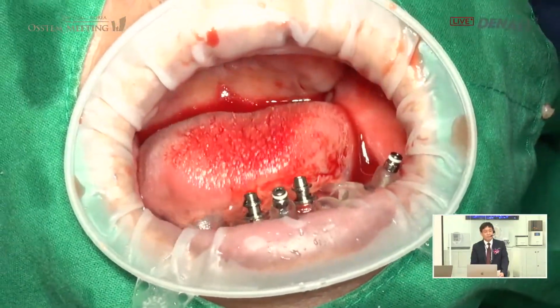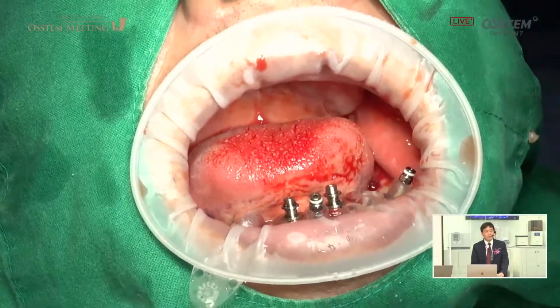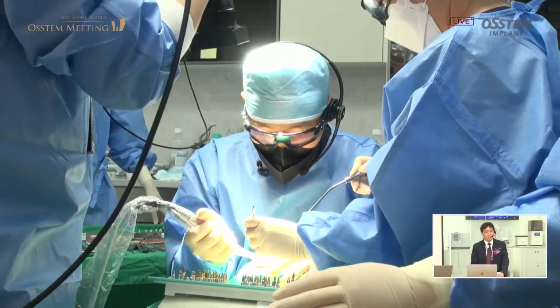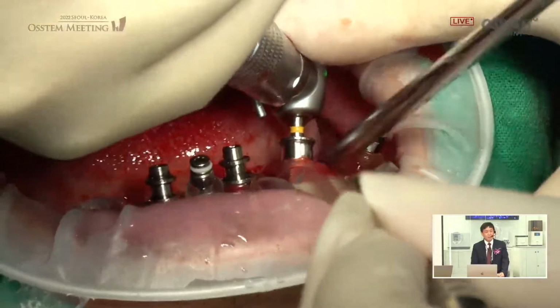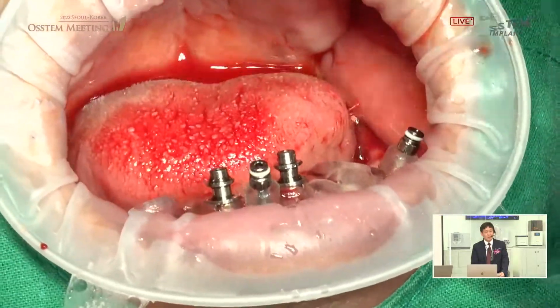What I'm using right now is a 7mm path drill. In number 35, because it's an extraction socket, the path drill is used so that the drill does not slip during preparation.